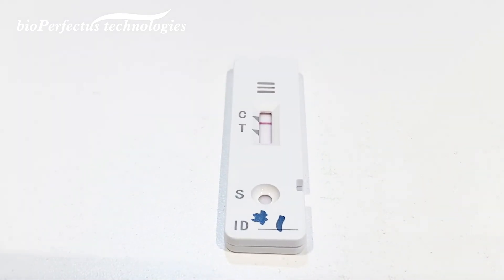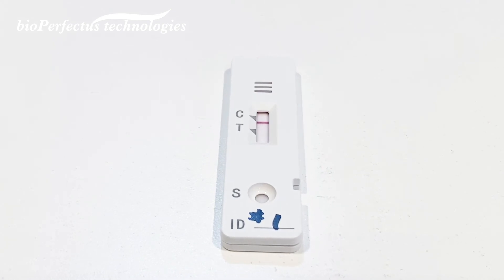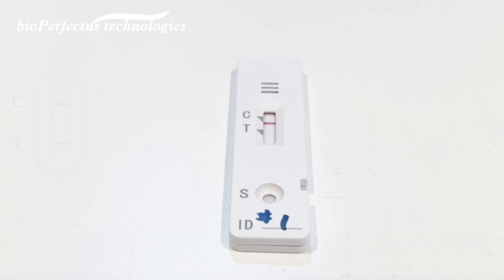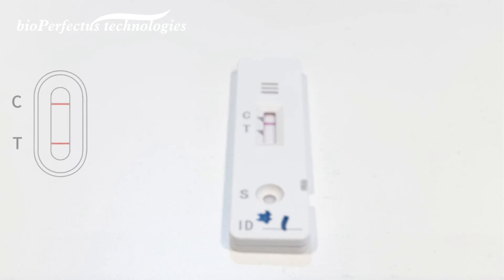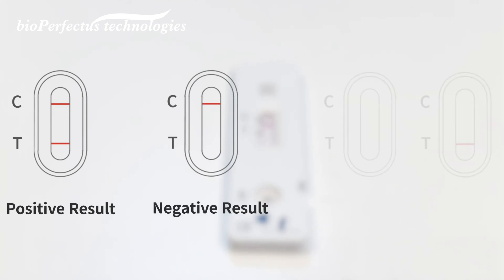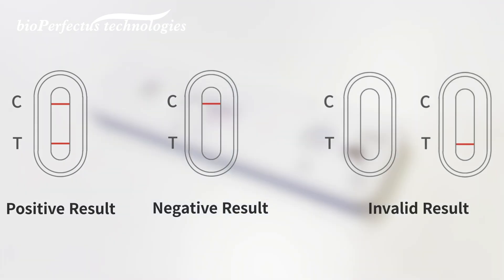Read the result according to the result interpretation on the operating card. If colored lines appear at both the T and C areas, the result is positive. If only one colored line appears at the C area, the result is negative. If no colored line appears at the C area, the result is invalid.